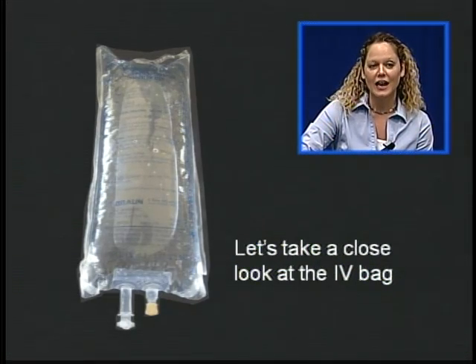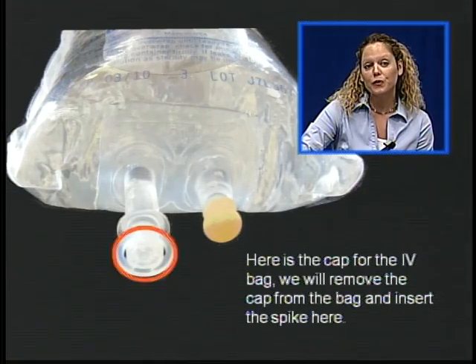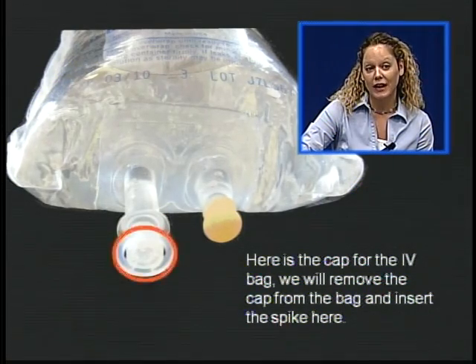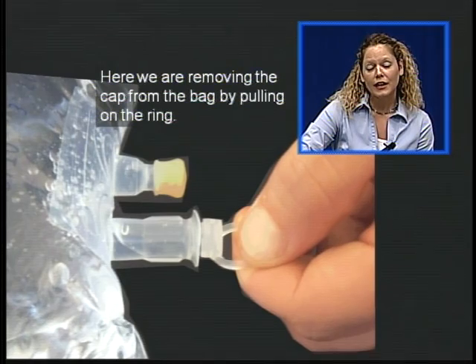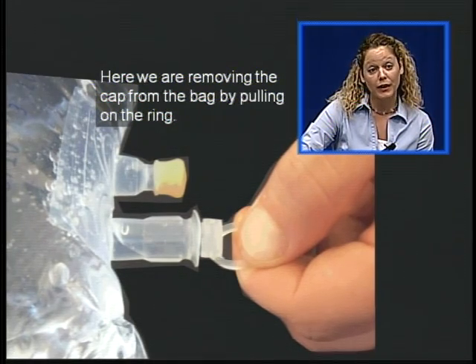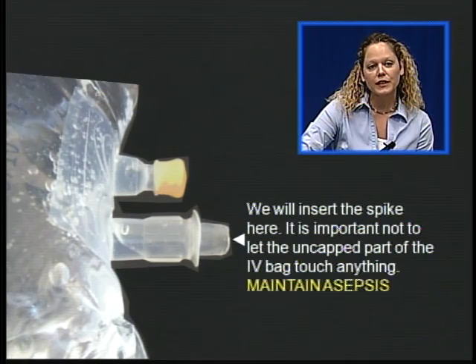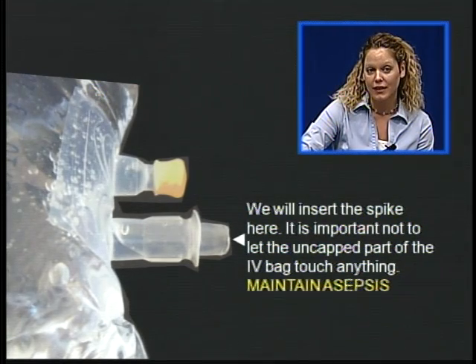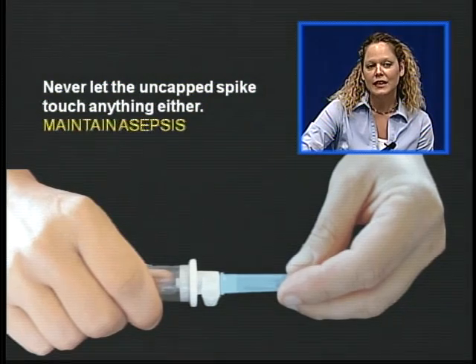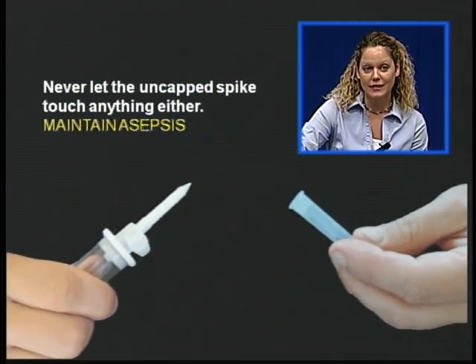Let's take a close look at the IV bag. Here's the cap for the IV bag. We will remove the cap from the bag and insert the spike here. We remove the cap from the bag by pulling on the ring. It is important not to let the uncapped port of the IV bag touch anything, always maintaining asepsis. Never let the uncapped spike touch anything either — always maintain asepsis.